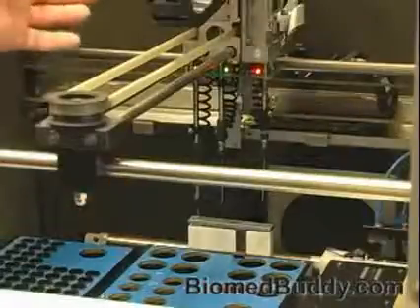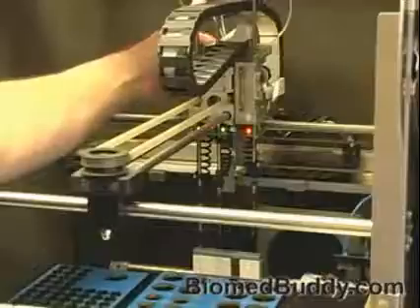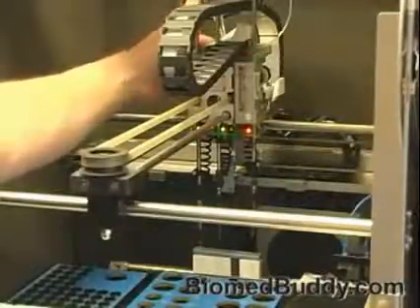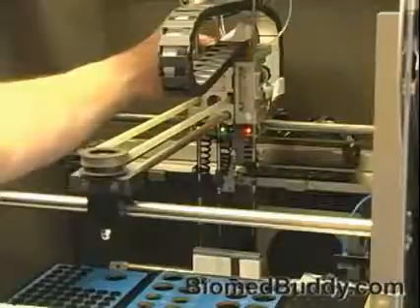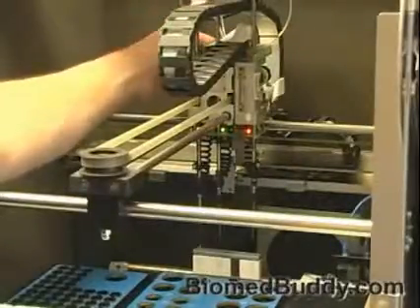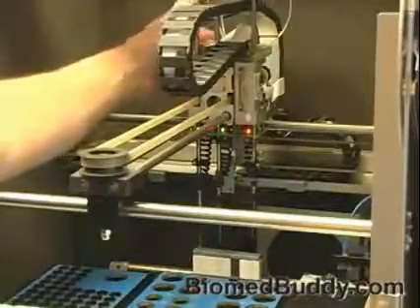Okay, it goes right in. I'm going to put my hand in back, and there's a little wheel, and you want to be a little careful with this, meaning that you don't want to press too hard on the wheel, but I'm going to move it up so that you can see that the wheel is there and that you can do it, and you also see me manhandle the arms.